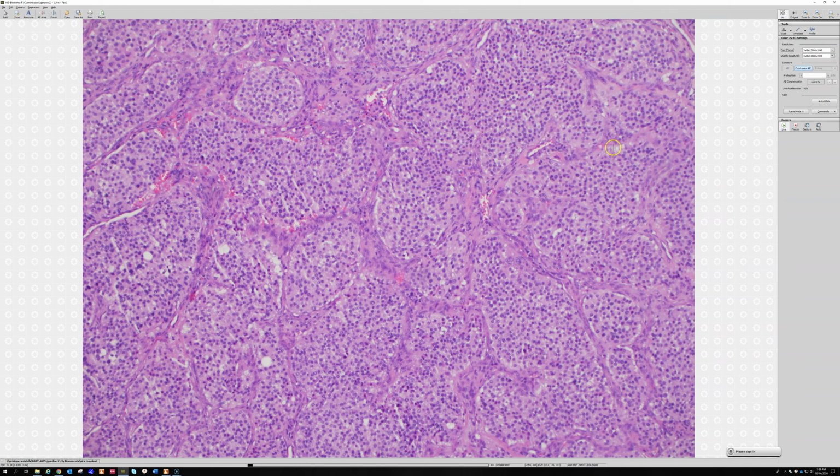So that's the main thing that we know, and a significant subset of them, depending on whether it's in the carotid area or if you have one in the adrenal, a subset of them will metastasize. And what's the special name you give to this tumor if it occurs in the middle of the adrenal gland? Pheochromocytoma is basically the same thing as paraganglioma. The only difference is the name: if it's outside of the adrenal, then it's called paraganglioma. They are basically the same tumor.